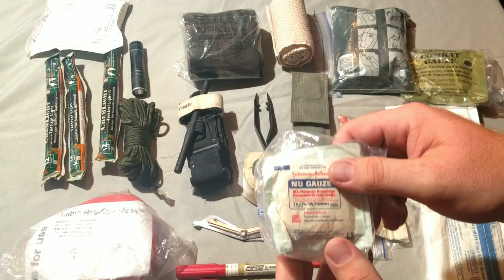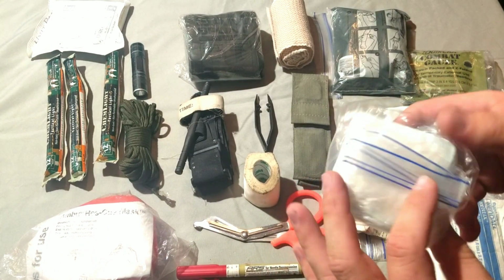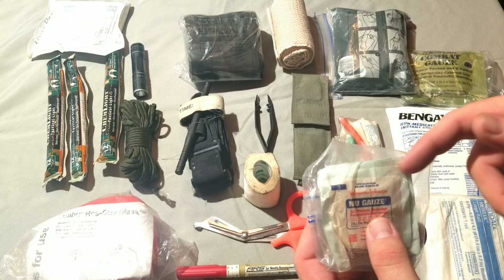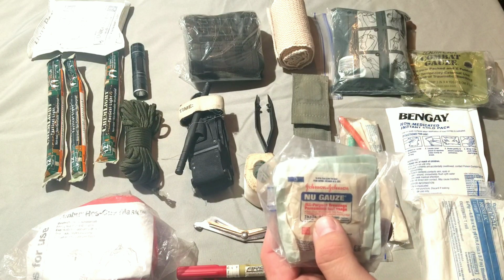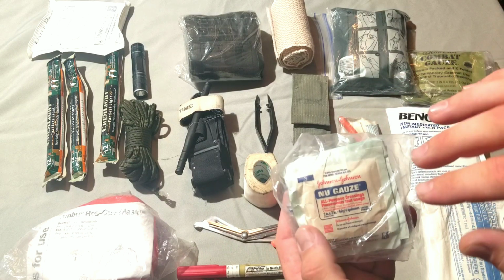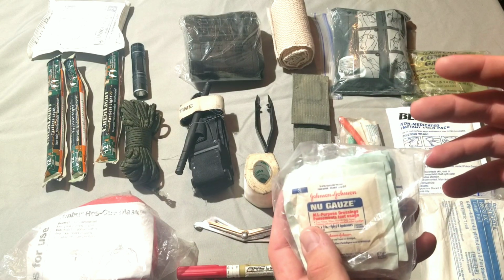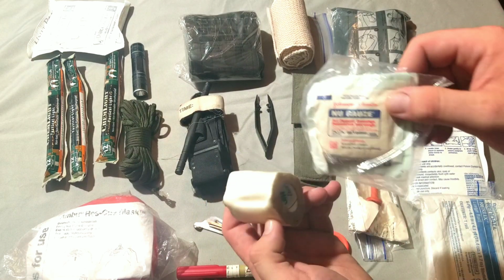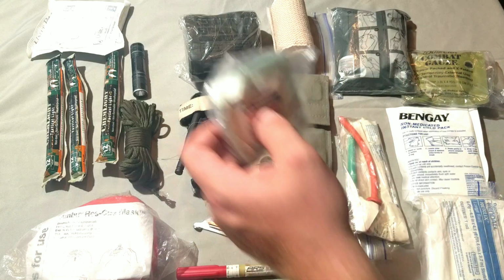And then we just have some more all-purpose gauze right here. A lot of people keep Band-Aids and stuff in there. I have these in individual little packages, and this is Johnson & Johnson. I know I was making fun of them earlier, but they do make a lot of good products like this, some more of the advanced stuff that you can do. I don't keep Band-Aids in here so much because they normally go bad from the heat. So keep this, got yourself some medical tape, even a little wound you can dress up and good to go.